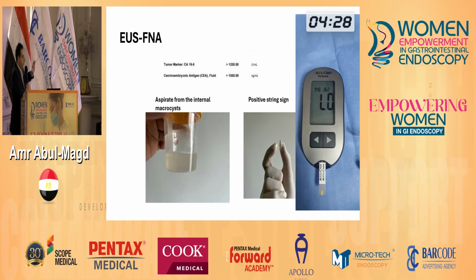And in my practice, this is the simple test I always do after any pancreatic cyst fluid aspiration. The glucose level in the cyst is low, and there is no doubt that it is not a pseudopancreatic cyst, and this is ideal of a mucinous cystic neoplasm.